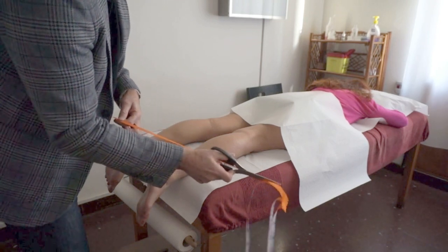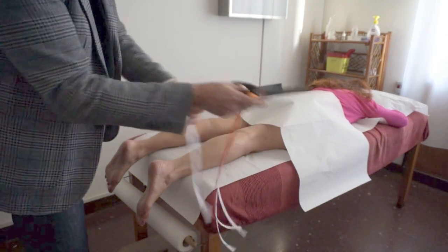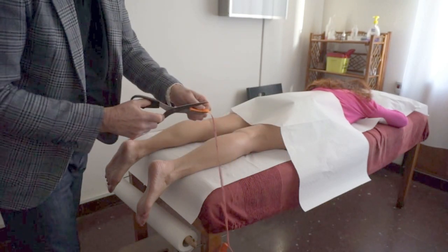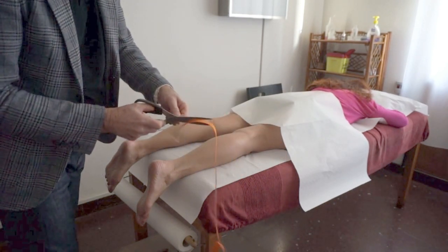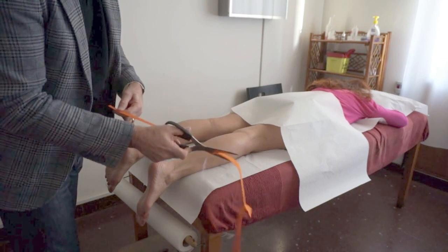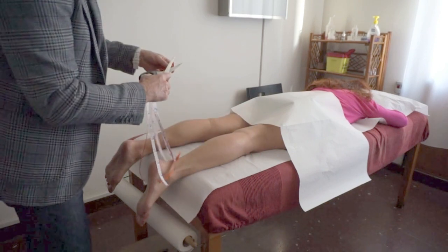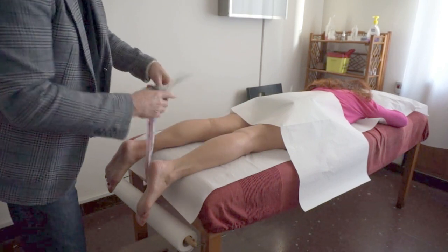The length of the tape is calculated 10 cm above the popliteal fossa, and the length is taken down 2 cm below the heel. In this area the skin elasticity is in a longitudinal direction, so consequently the tape will be applied longitudinally.